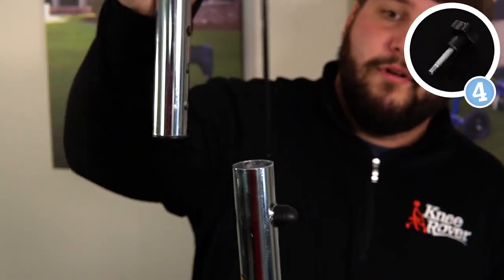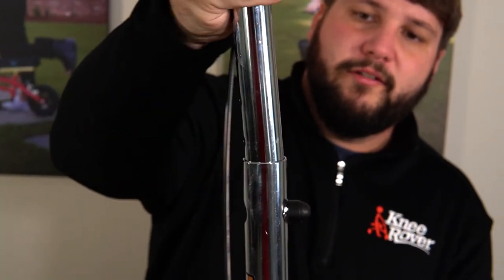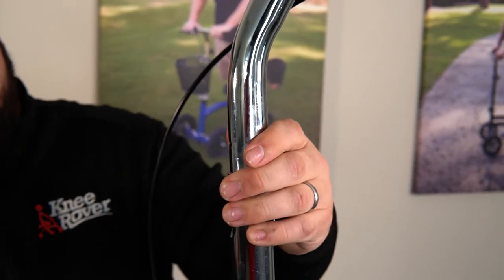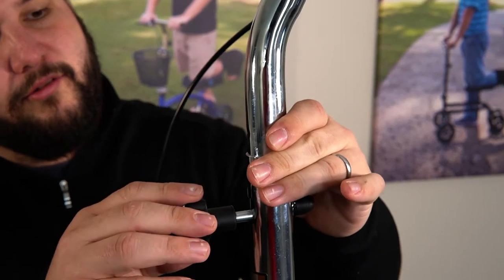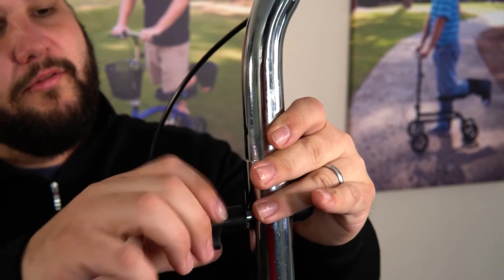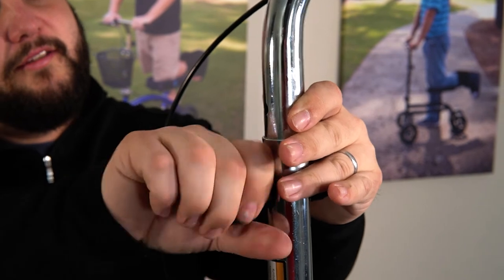Step number four is the handlebars. We're going to drop these in here. Take your height adjustment knob, select your desired height, and then screw the bolt in here. Just make sure you screw it all the way in to secure the handlebars — make sure it's nice and tight.